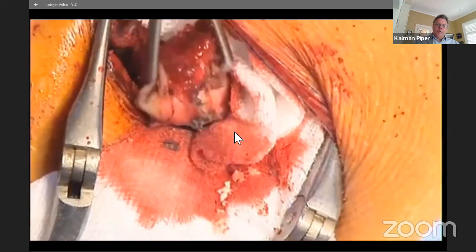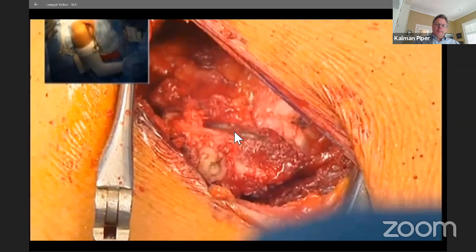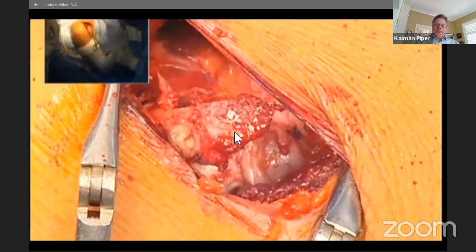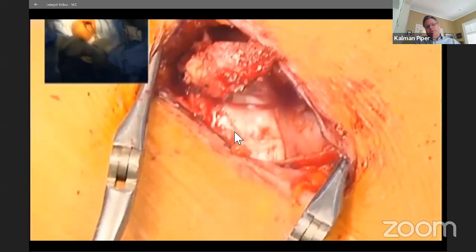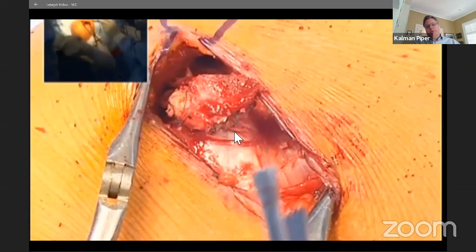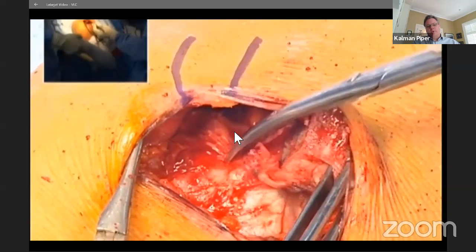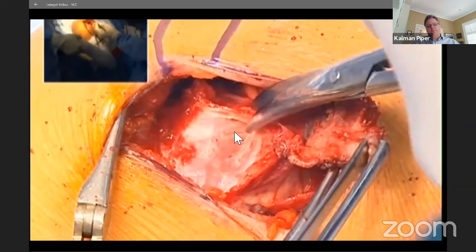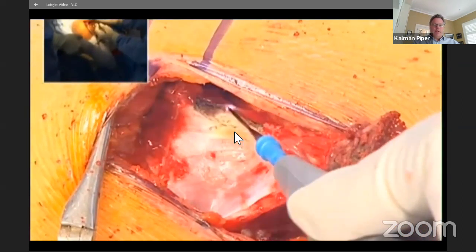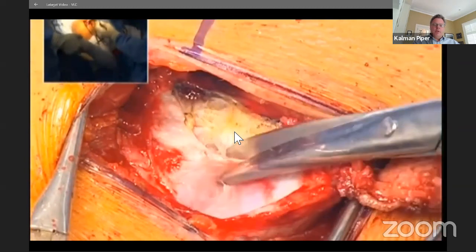2 screw holes about 1 centimetre apart. So the graft is now moved medially, and the soft tissue dissection continues to expose the subscapularis tendon. These are the fibers of the clavipectoral fascia. You can see the subscapularis tendon underneath the clavipectoral fascia.